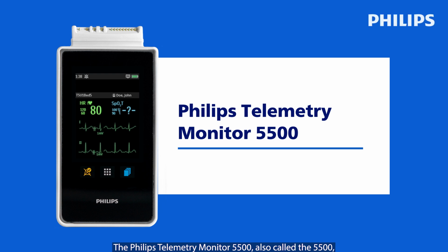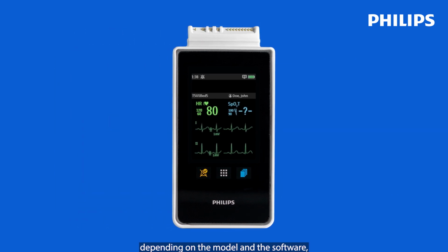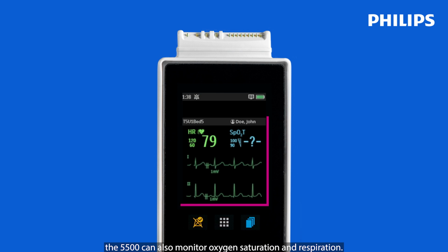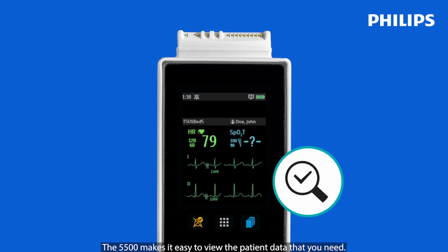The Philips Telemetry Monitor 5500, also called the 5500, provides continuous monitoring of ECG. Depending on the model and the software, the 5500 can also monitor oxygen saturation and respiration. The 5500 makes it easy to view the patient data that you need.